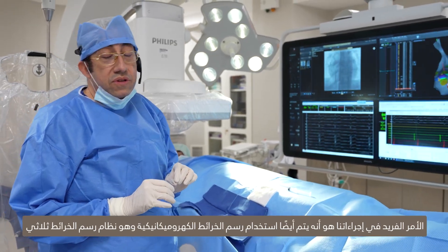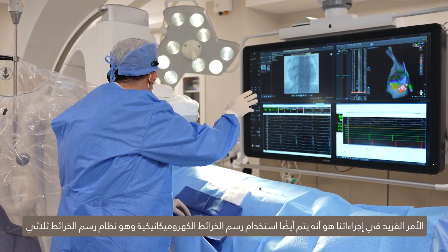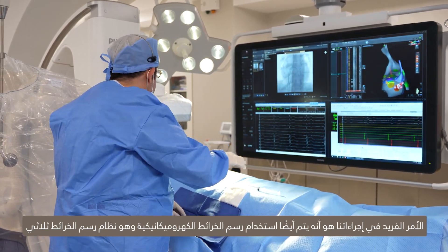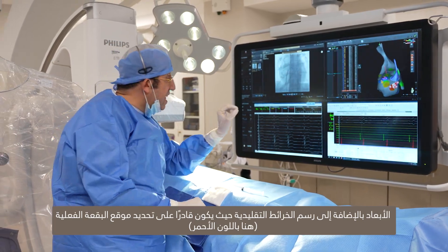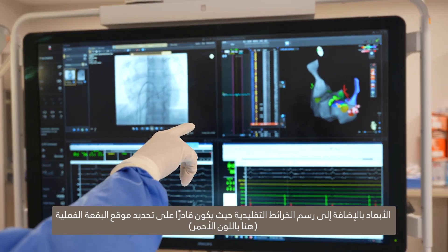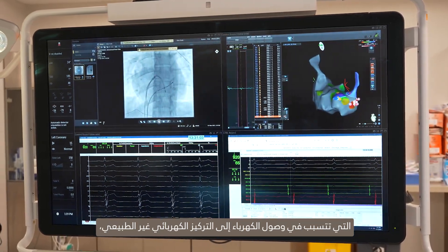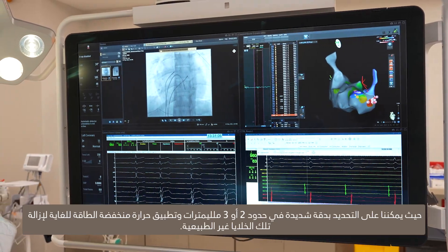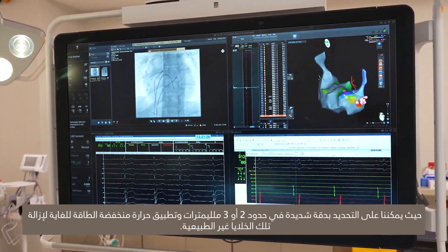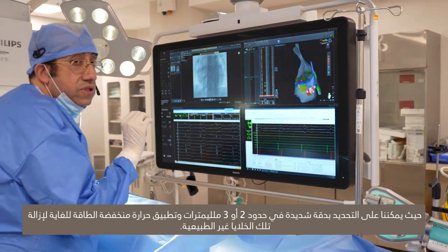What is unique about our procedure is that we are also using electro-anatomical mapping, which is the 3D mapping system, as well as the conventional mapping. We are able to locate the actual spot — shown here in red — that causes the abnormal electrical focus. We are able to identify it very precisely within two or three millimeters and apply a very low energy heat in order to remove those abnormal cells.